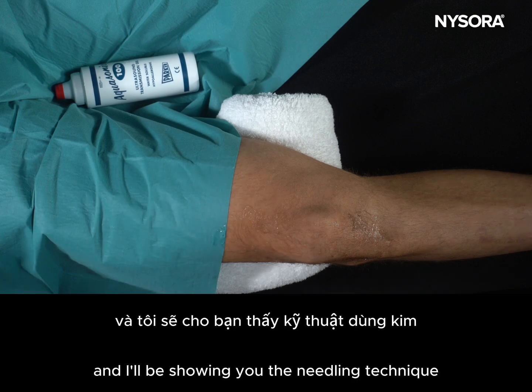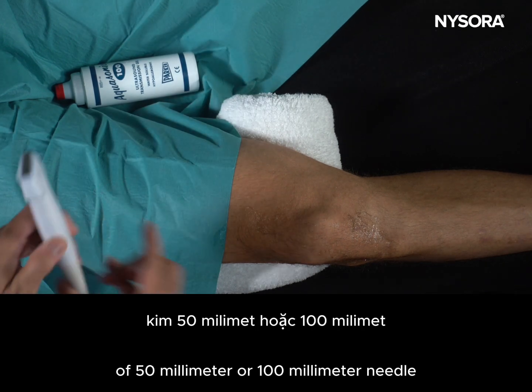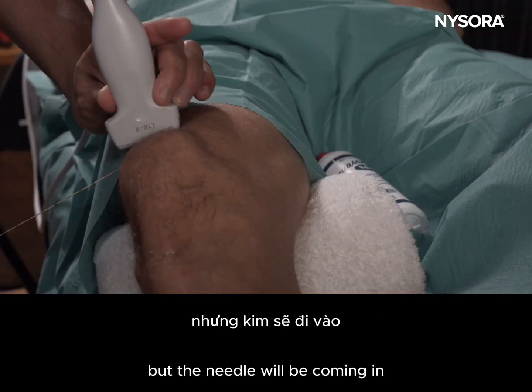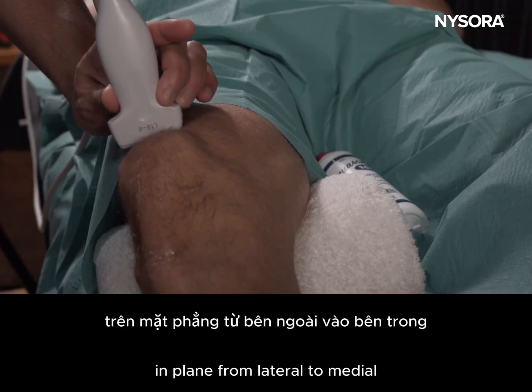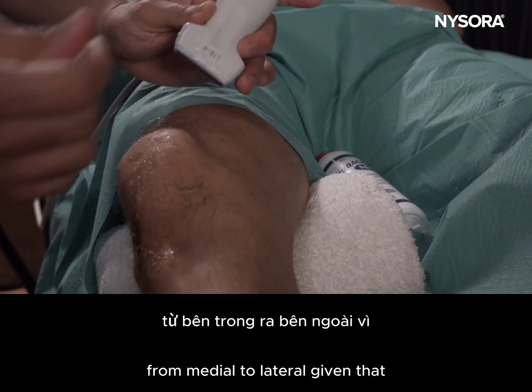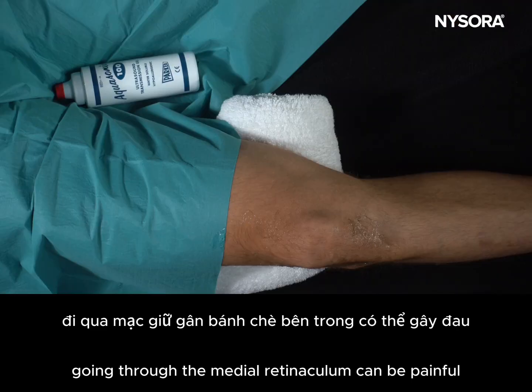And I'll be showing you the needling technique of a 50 millimeter or 100 millimeter needle based on the patient's body habitus, but the needle will be coming in plane from lateral to medial, which is much more comfortable than coming through from medial to lateral, given that going through the medial retinaculum can be painful.